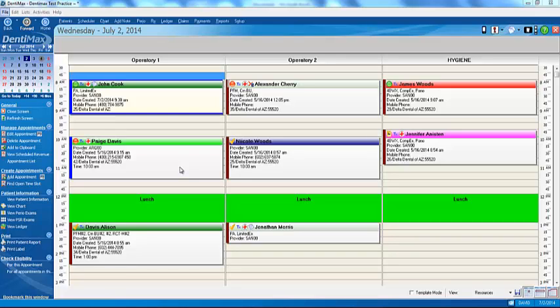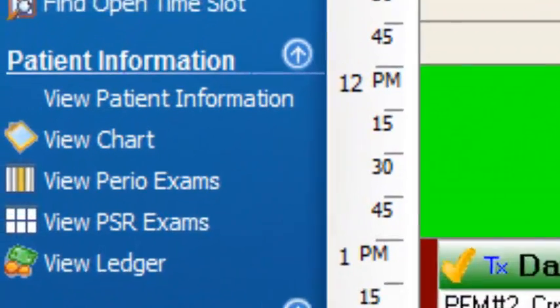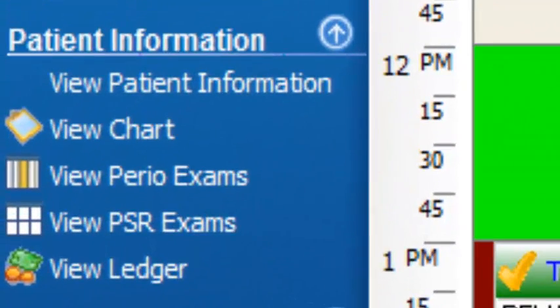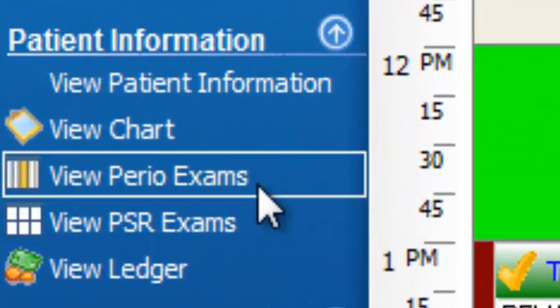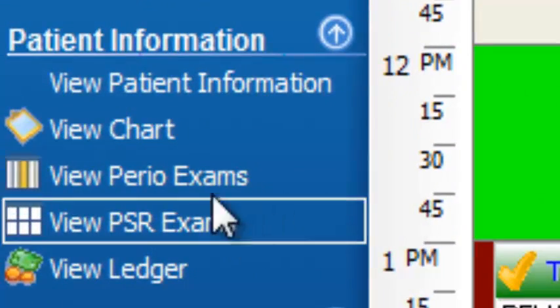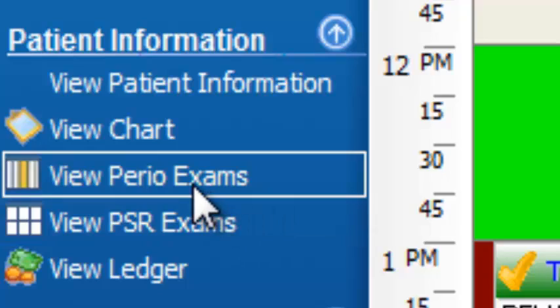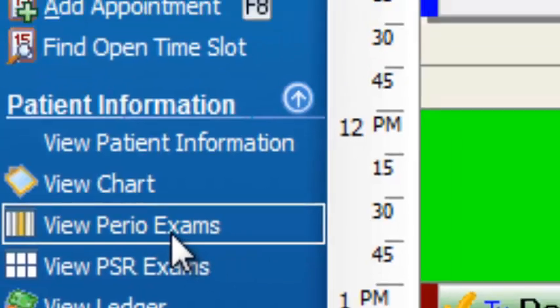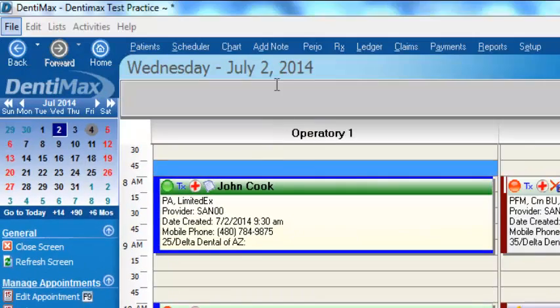Entering perio measurements is a snap from within Denimax — it's super easy to do. If you're in your appointment book and need to access your perio measurements, you can go to the left-hand side of your screen and click on the view perio exam button.